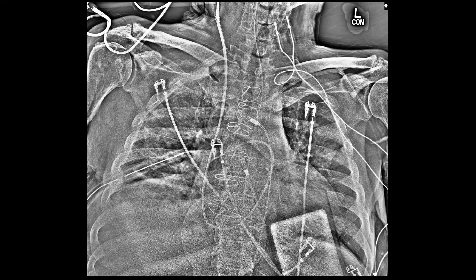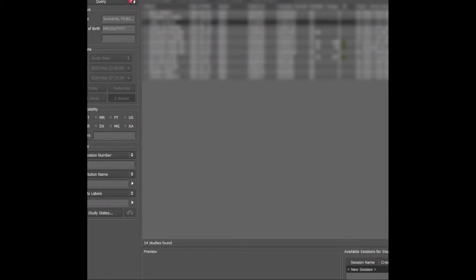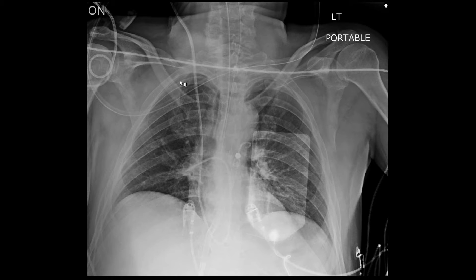On occasion, a variant of the Impella may be used for right ventricular assist. In this configuration, the direction of flow differs from LVAD function. The Impella enters from the IVC, traverses the right atrium and ventricle into the right ventricular outflow tract, with the tip in the region of the main or proximal left pulmonary artery. The J-tip is now oriented in the outflow direction, so blood flows in from the IVC and is pumped into the pulmonary artery distally.